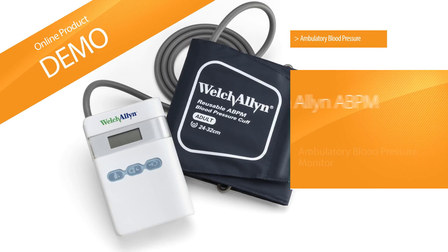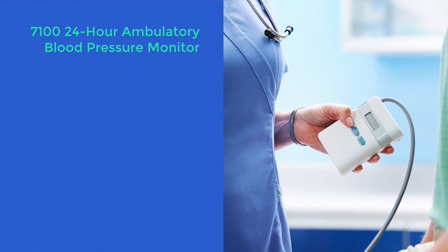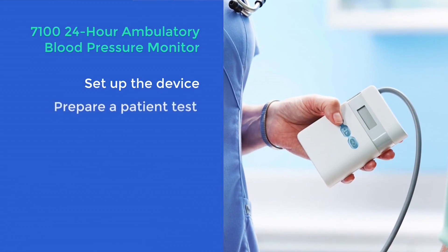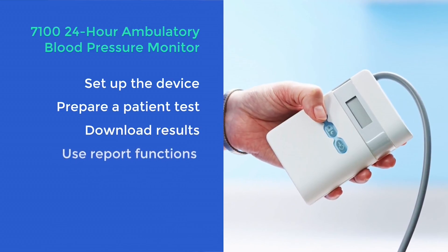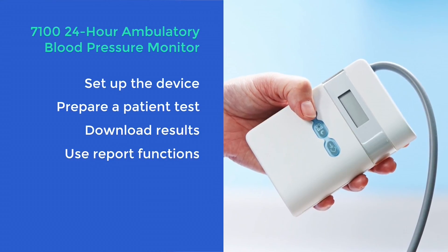Welcome to this demonstration of the Welch-Allen 7100 24-hour ambulatory blood pressure monitor. This film has been designed to show you how to set up the device, how to set up a patient test, how to download the results after a patient test, and also how to use some of the report functions available in the CardioPerfect software.